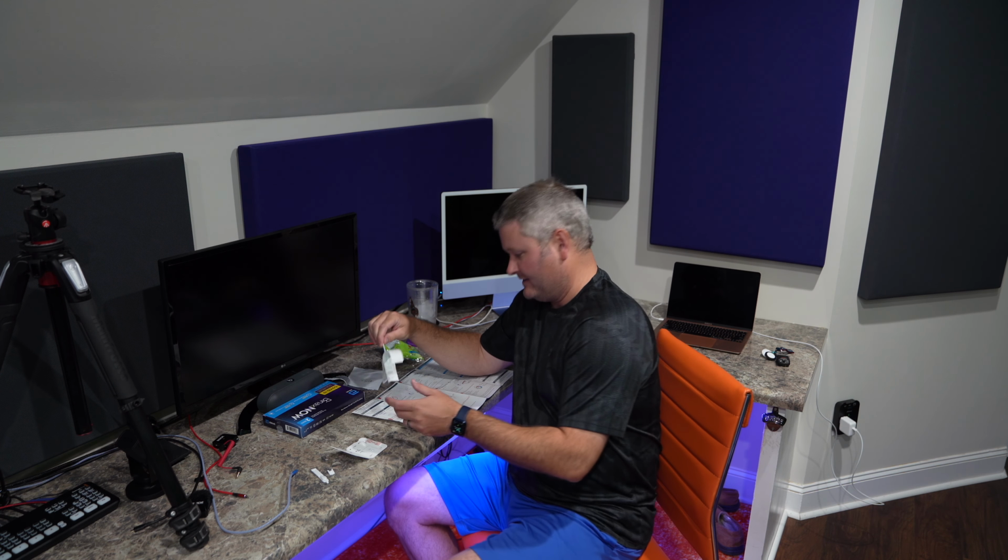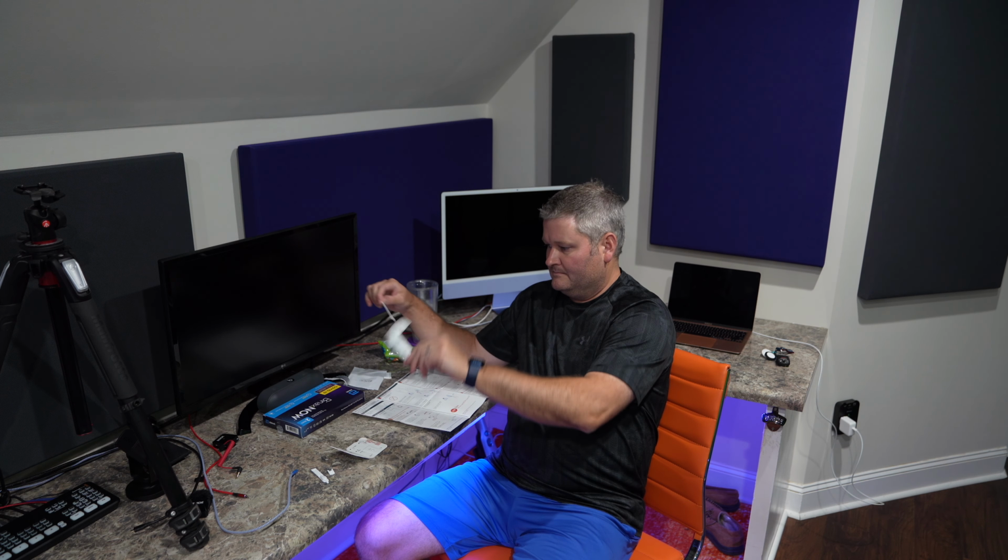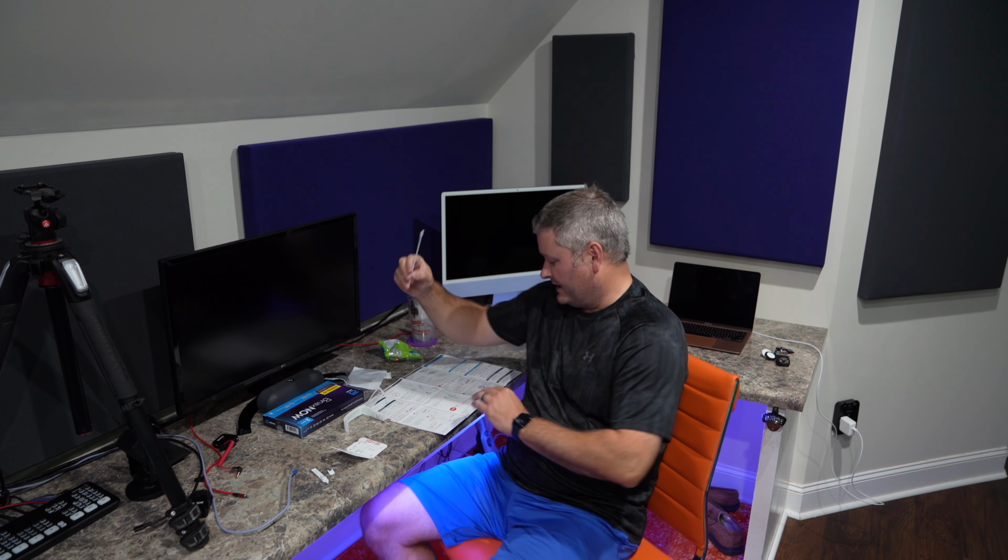So we're going to set a timer for 15 seconds. Hey Siri, set a timer for 15 seconds. Okay, 15 seconds and counting. Okay, that's my right nostril. Same swab. Hey Siri, set timer for 15 seconds. Okay, 15 seconds and counting. Okay.